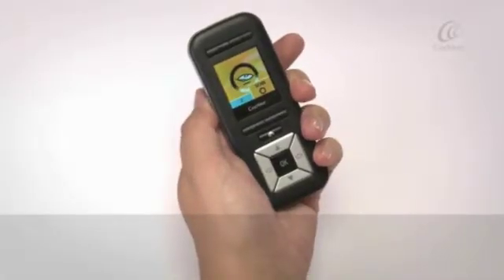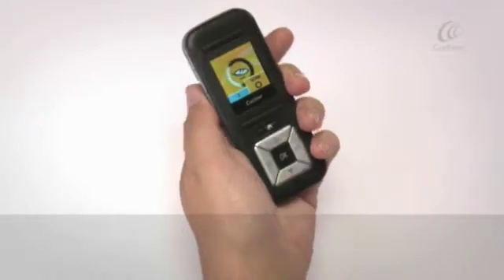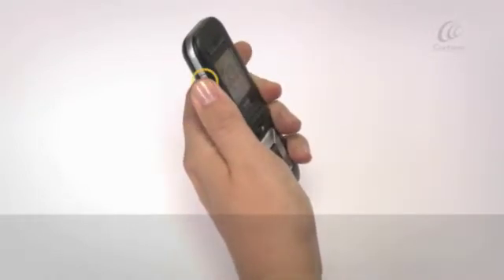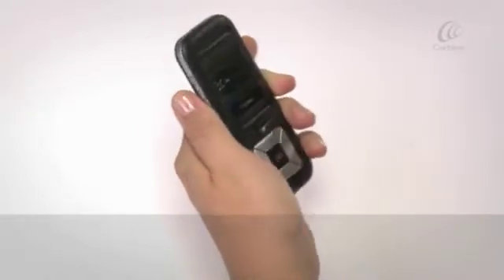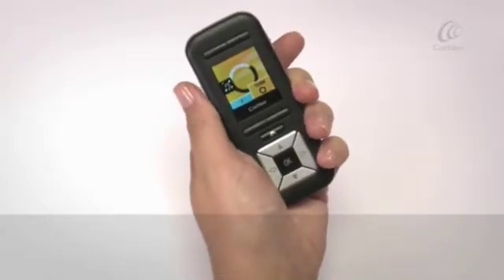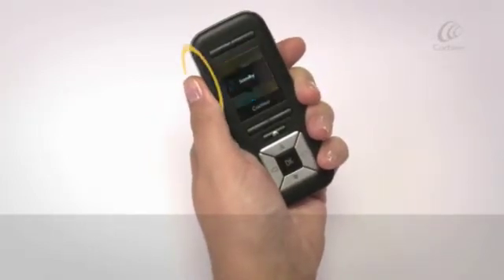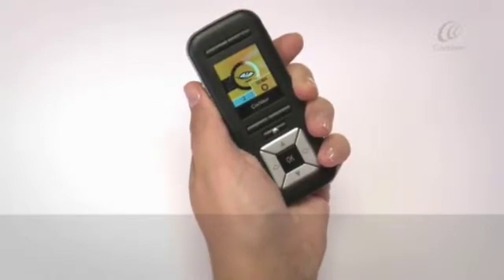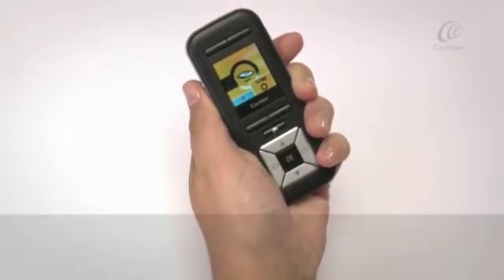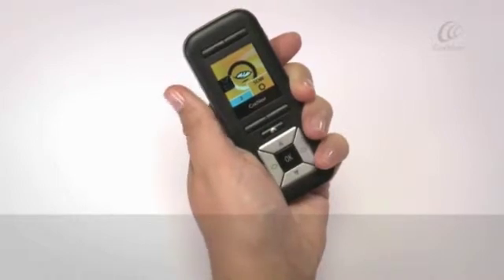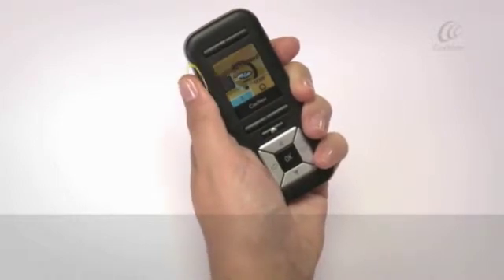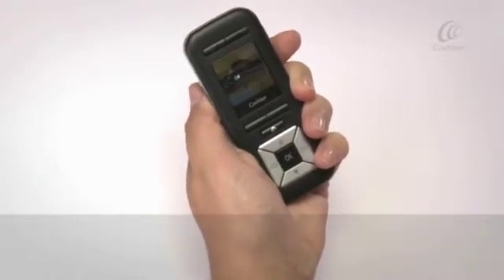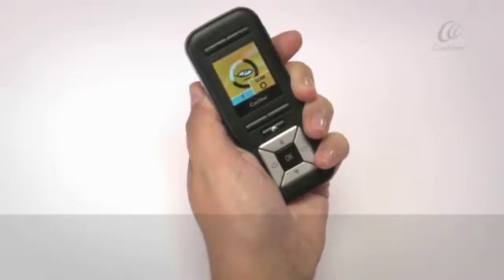To use telecoil or auto telecoil, press the telecoil button once to turn telecoil on. Press the telecoil button again within five seconds to turn auto telecoil on. Press the telecoil button again to turn telecoil or auto telecoil off.